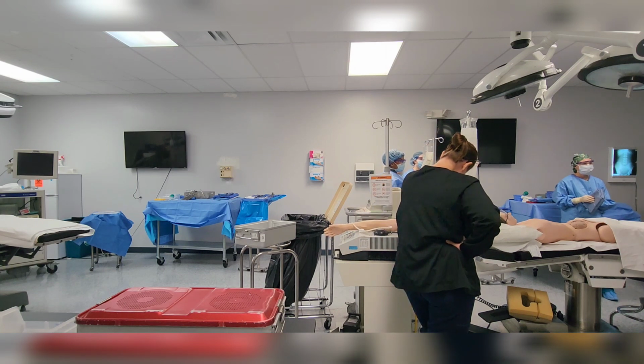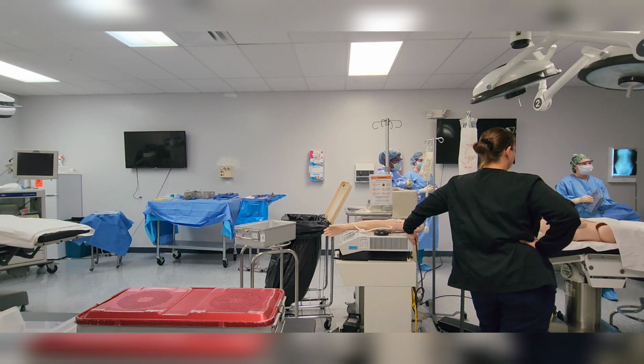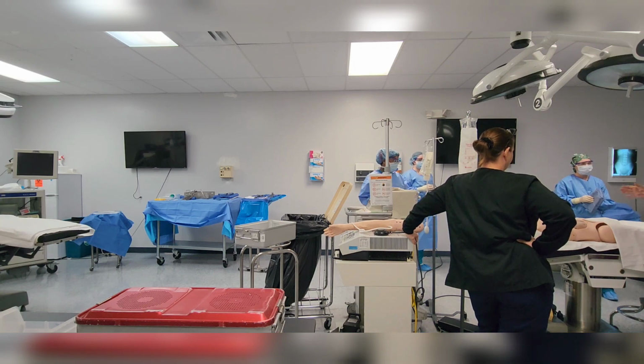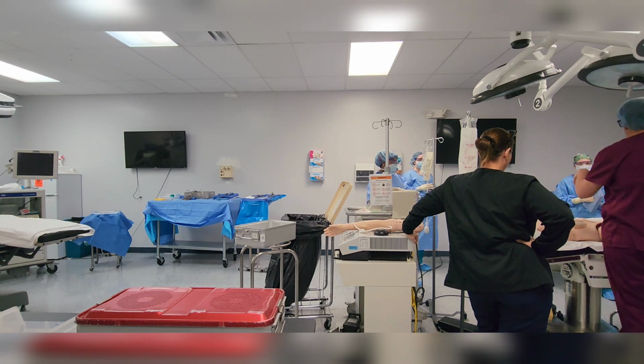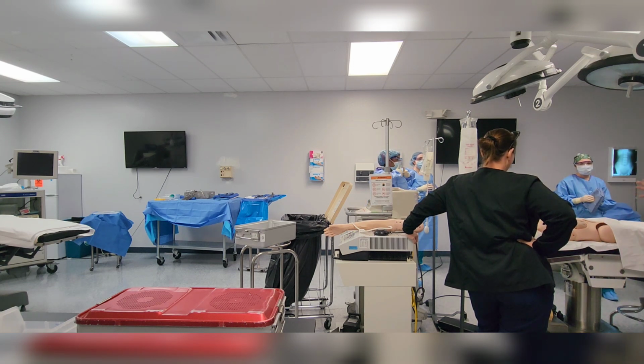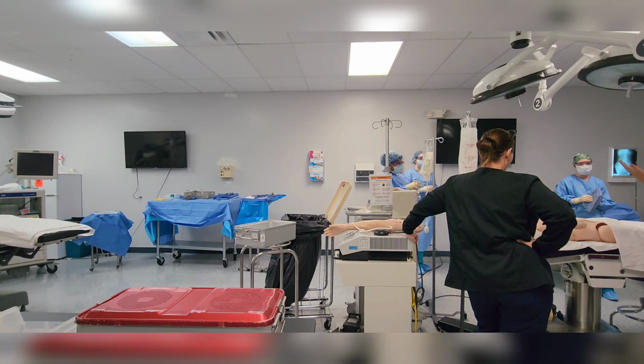It is true, right? By the book, we train you to do a down sheet first and square off the incisional site. We prep around and then put the drape on. And doctors sometimes do it differently. Like Dr. Patel, he squared off first and then put a down sheet. It is a variety of things, but by the book, we're going to do that today.